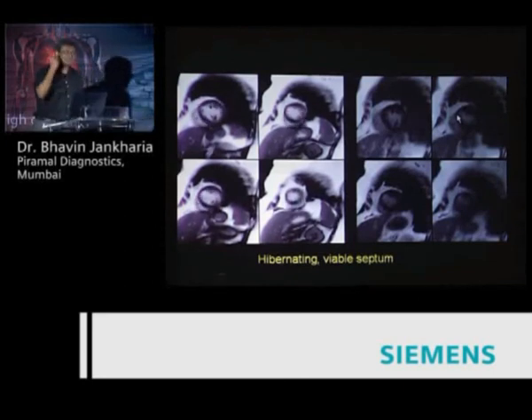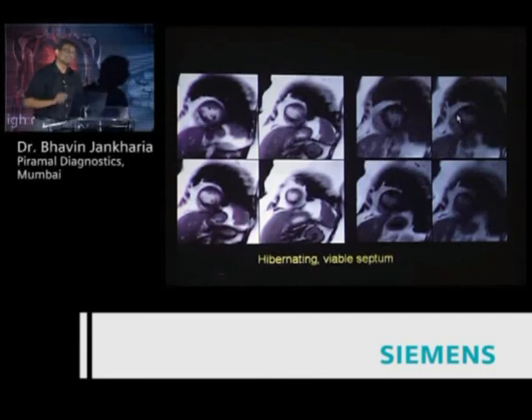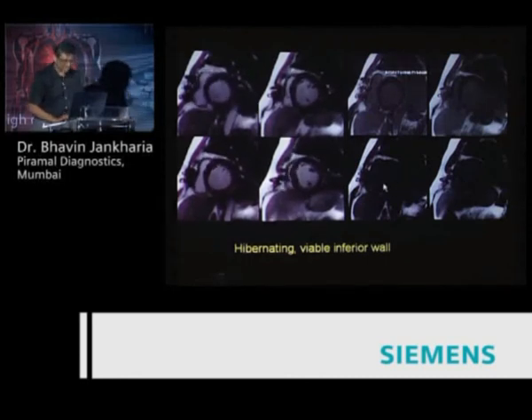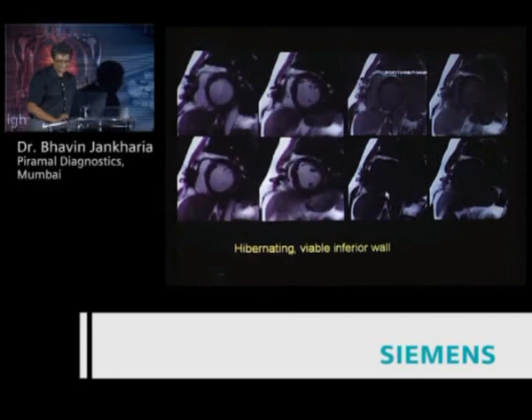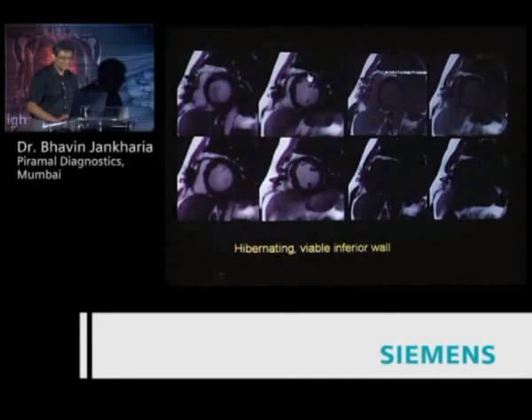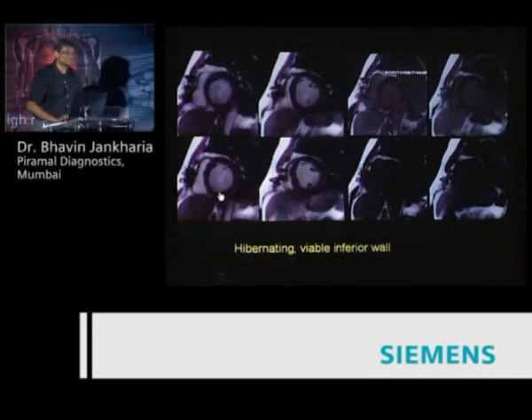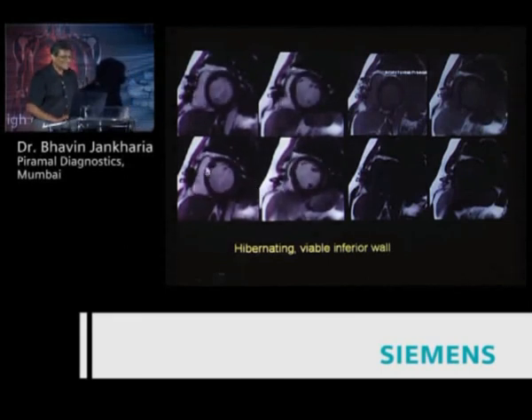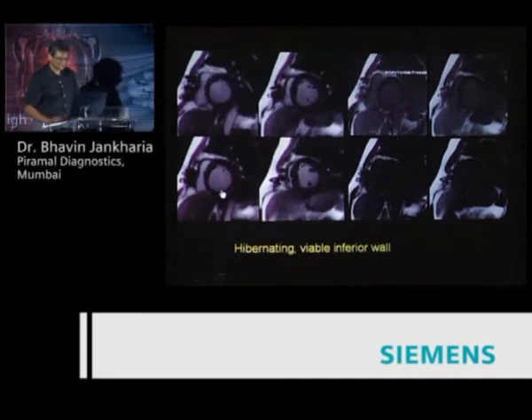When there is no infarction, it means that if you revascularize the LAD, the patient has a very good chance of septal function improving. Here is another patient with a less than 25% infarct — a very thin infarct along the inferior wall — and severe hypokinesia of the inferior wall, while the lateral and anterior walls contract well. This means the myocardium is hibernating and potentially viable.